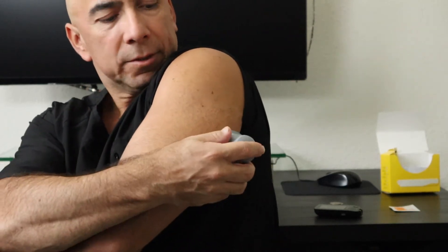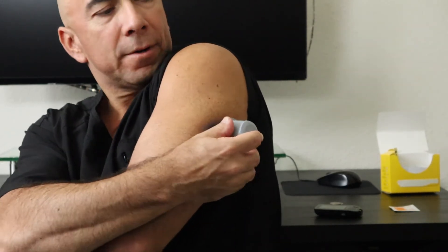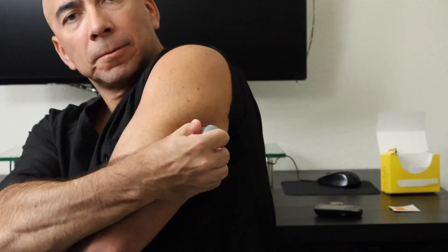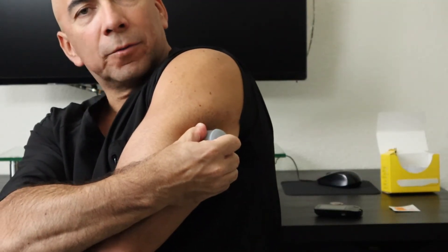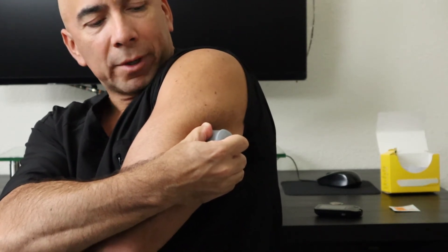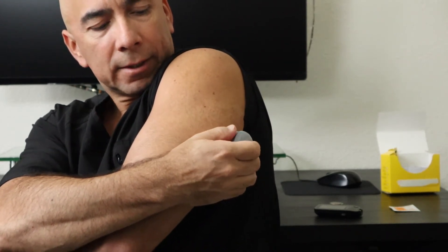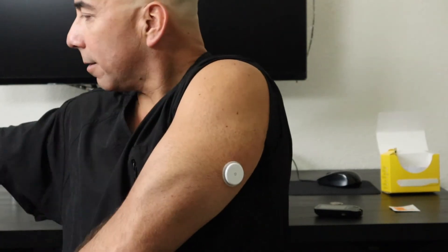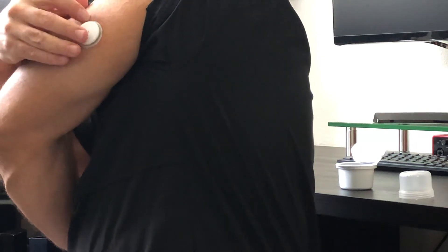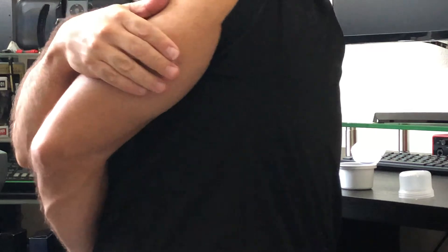We're just going to place this right over the top here and press it in. Hold it for a little bit just to let the glue from the sensor kind of stick. Then take that right on off — and that's what it looks like right there. I'm just going to make sure this part sticks really good.